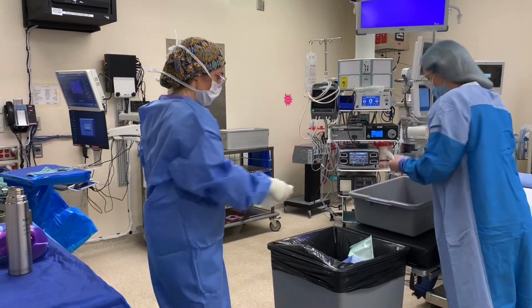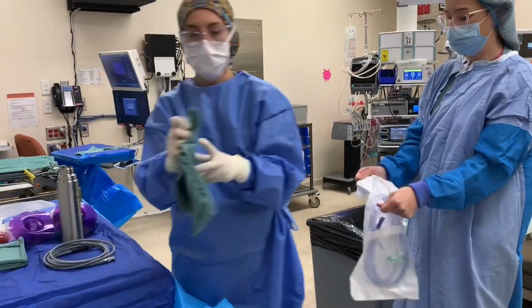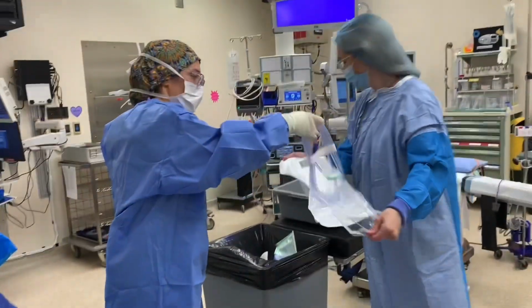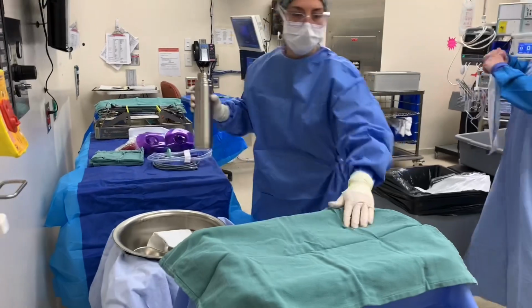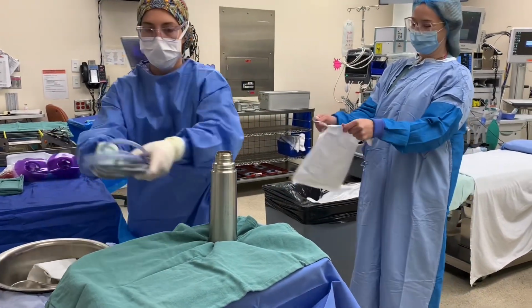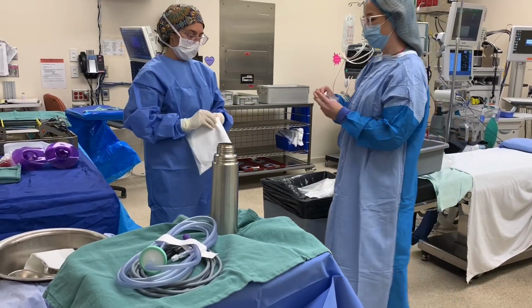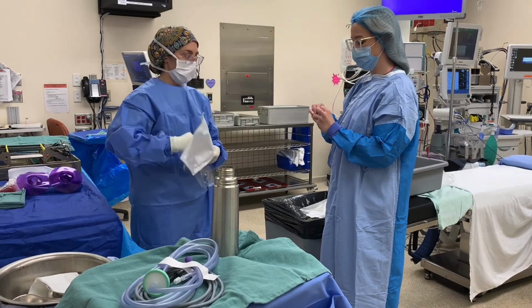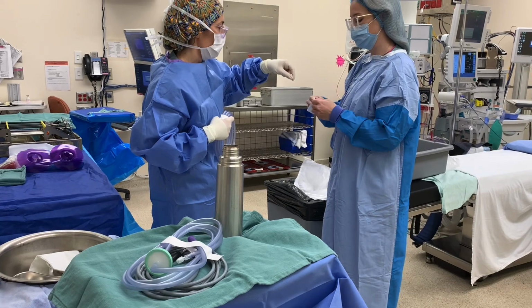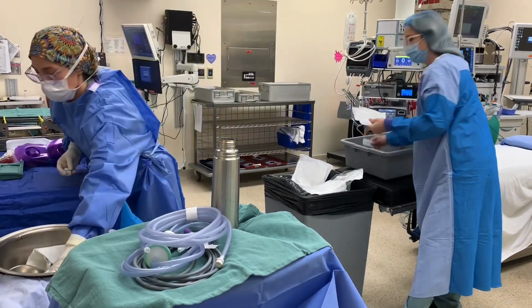All sterile indicators are being confirmed visually by either the scrub or the circulating nurse when they're being opened and handed off like this. This is another way that things can be checked and ensured for sterility. Oftentimes, if items are flipped into the basin, we are unsure, and some incidents and good catches have been made and sets have been torn down because once the scrub scrubbed in and retrieved items from their basin, they found that in the white paper wrappings there were no sterile indicators.